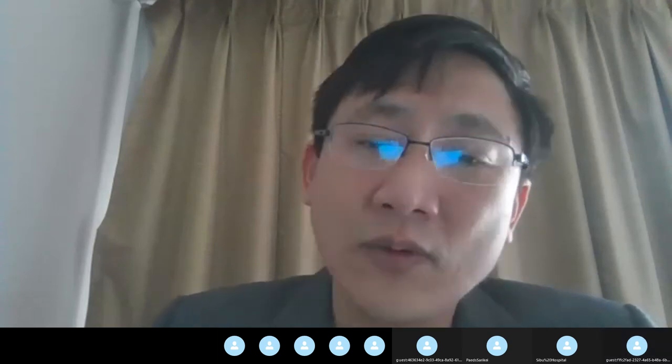So this question is about the I-time. There are two ways of doing it, depending on the concept that you want to use. If your concept is to support the respiratory rate of the patient, and you're going to have a backup rate for the patient, then you need to set according to the patient's inspiratory time. Whereas if your main purpose is lung recruitment, the I-time that we put can be a bit higher than the normal inspiratory time, which means it can be 1 second to 1.5 seconds, provided the time is set in.